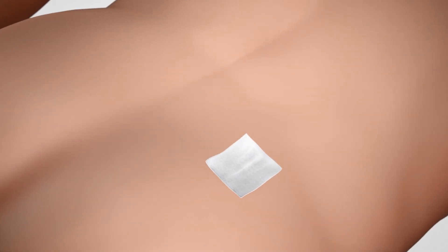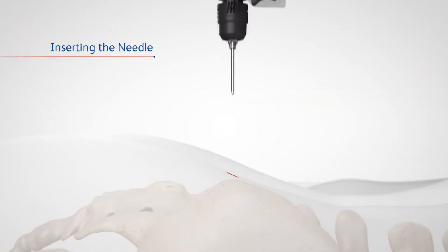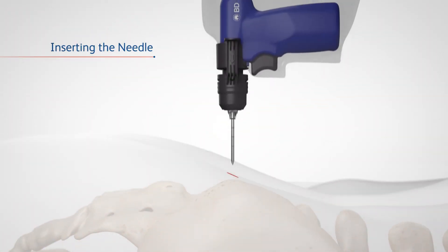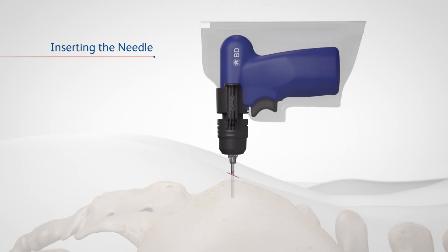Now, prepare the biopsy site using aseptic technique and puncture the skin with a scalpel. Next, insert the needle assembly through the skin incision and lightly squeeze the trigger to slowly advance the needle to the target site.